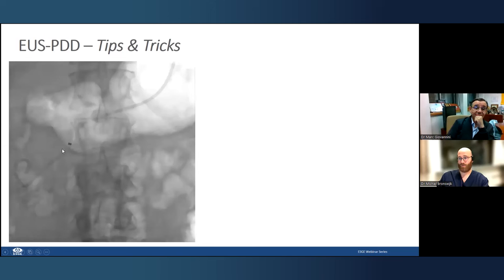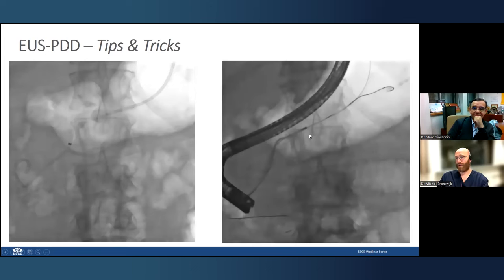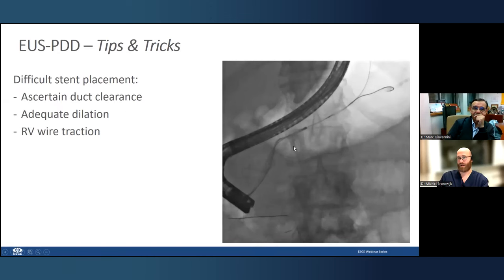So this is a challenging patient with a ruptured duct. Here, rendezvous wasn't possible either. So we performed pancreaticogastrostomy and also retrograde stenting through the papilla. And then we called the patient back after 3 to 4 weeks. And then with the use of spyglass, we could perform lithotripsy and also integrate guide wire placement and rendezvous. What we typically see in these duct rupture patients is that the place of the duct rupture becomes very fibrotic and very challenging to place a stent.